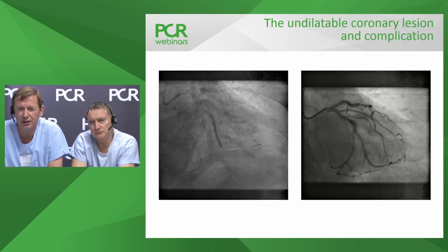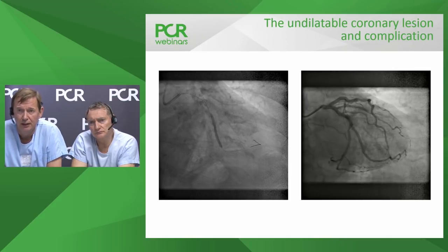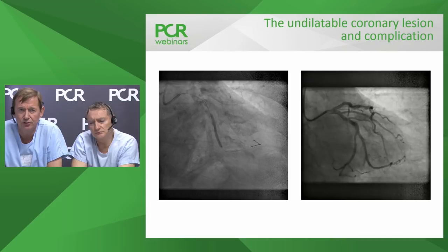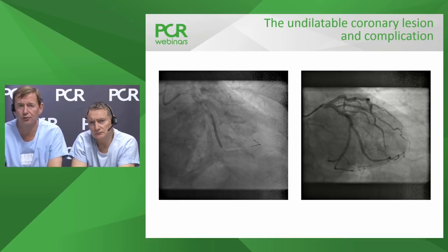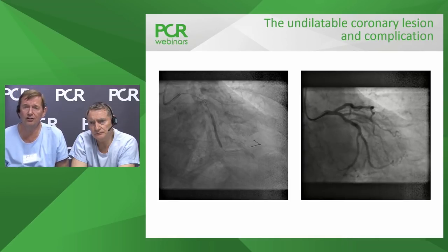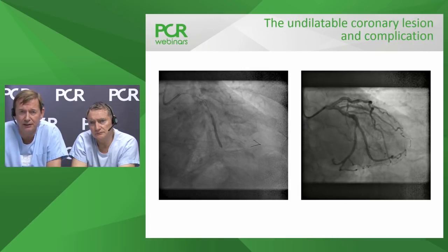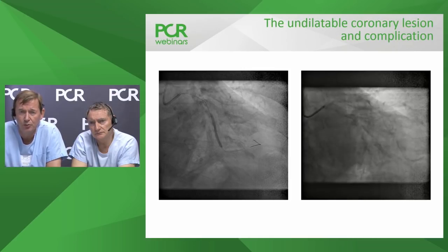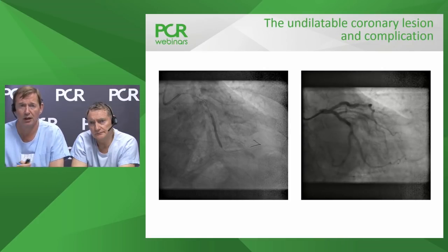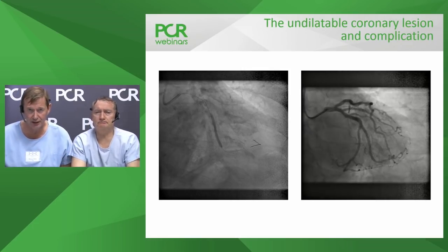And it really demonstrates that if you don't prepare calcific, complicated lesions properly, then you'll end up with significant complications. And those of us who are committed to treatment of calcific lesions turn to this technology quickly and early, because it makes complicated cases much easier. And I think the new technology that we've seen on this webinar will certainly make the take-up and practice of rotational atherectomy very much easier. So thank you to all involved. Thank you very much to Professor Carrier here.